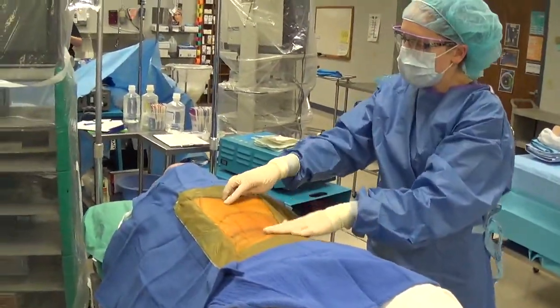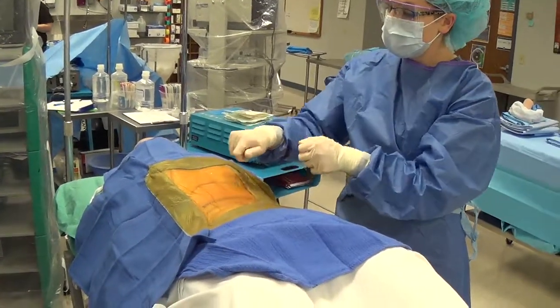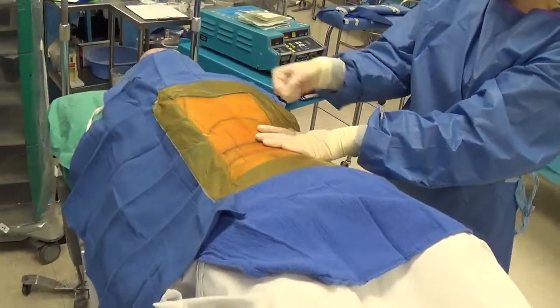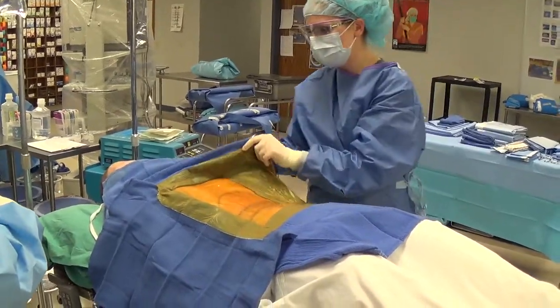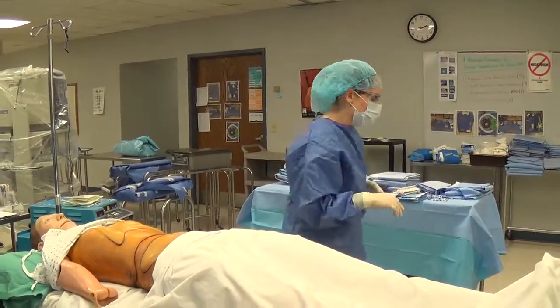The Ioban stays on throughout the case until we start to close the skin, then we peel back the edges. For elderly patients, don't just rip it off because you might take their skin with it — be very careful when removing it. We'll take it off now to show you the application of paper square-off towels.